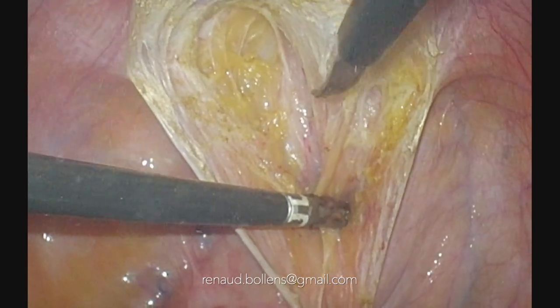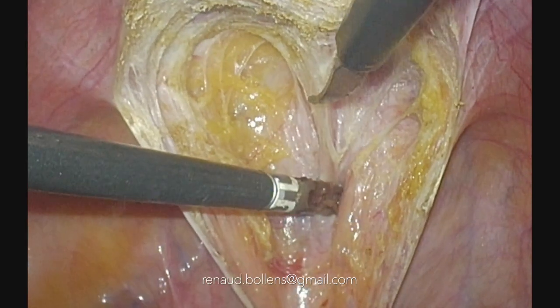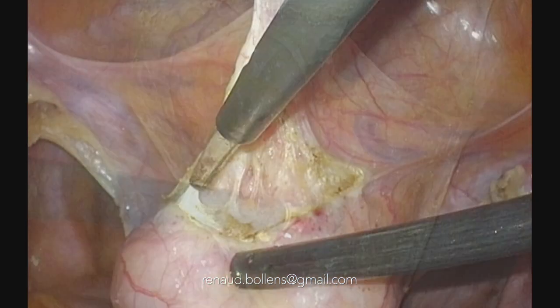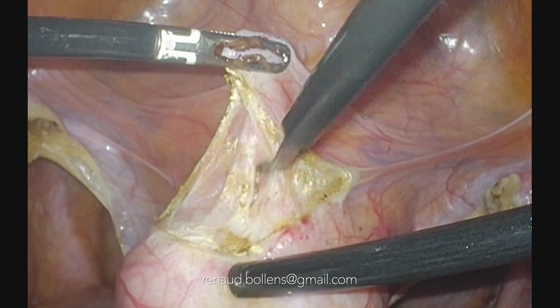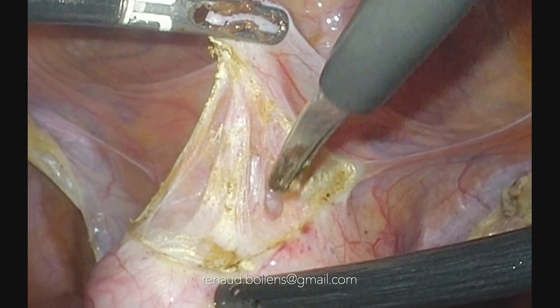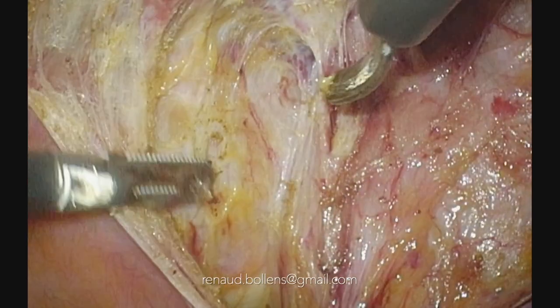And I just push gently. The coagulation just reduces the risk of small bleeders. But it's the tension and the pressure that will show me where is the good plane. When I push one more time, the plane that I want to dissect is the plane of the vagina. Then I don't push in this manner, because like that I enter in the bladder. Then I dissect and I push with the elliptic movement parallel to the plane that I want to dissect, and this is the vagina.